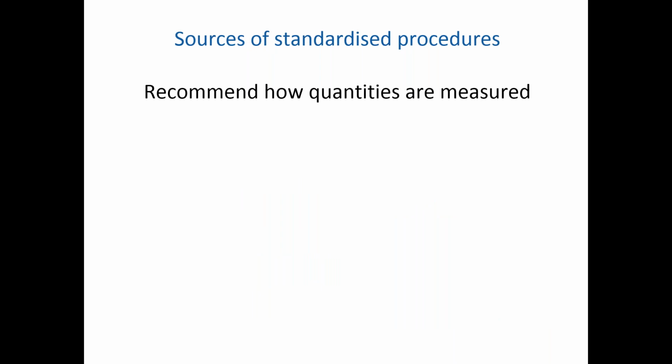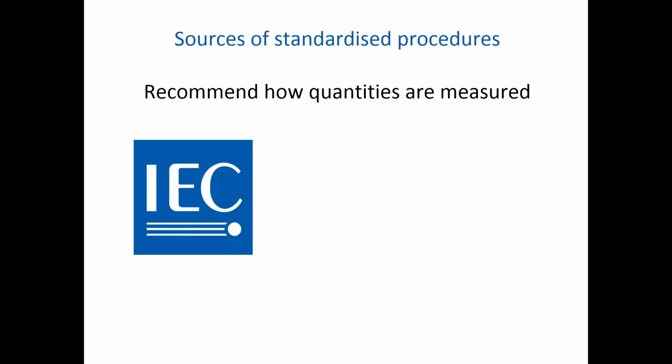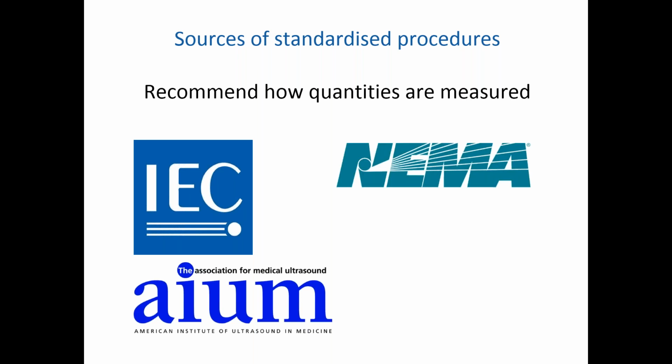Who recommends how quantities are measured? Well, the biggest source of ultrasonic related regulations at the moment is the IEC, the International Electrotechnical Commission. This is formed with representatives from many nations around the world, and there's active participation from at least 40 nations in the ultrasound group. There are also local US regulations, particularly UD2 and UD3, which people may be familiar with, that have come from AIUM and NEMA.